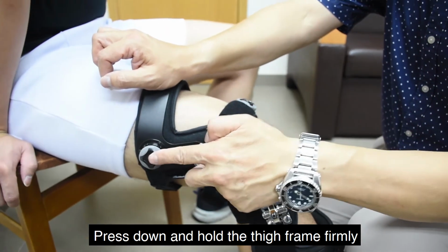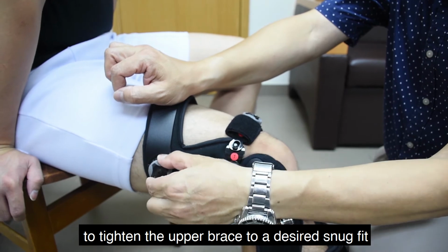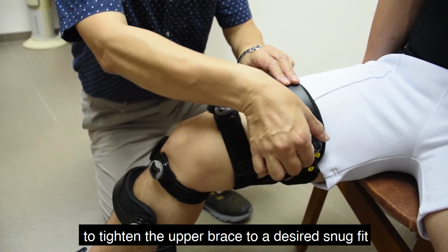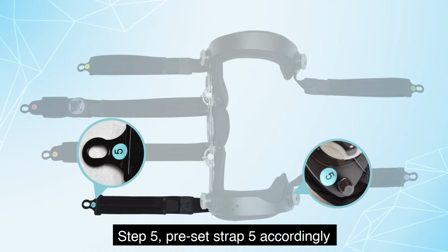Press down and hold the thigh frame firmly. Press and turn the two cinch devices to tighten the upper brace to a desired snug fit. Step 5. Preset strap 5 accordingly.